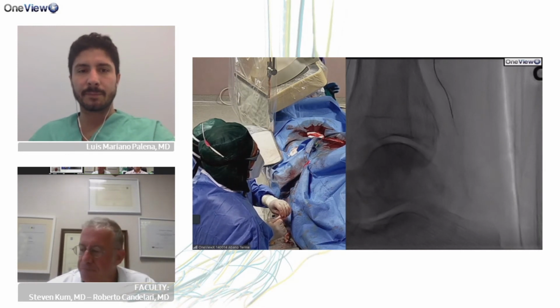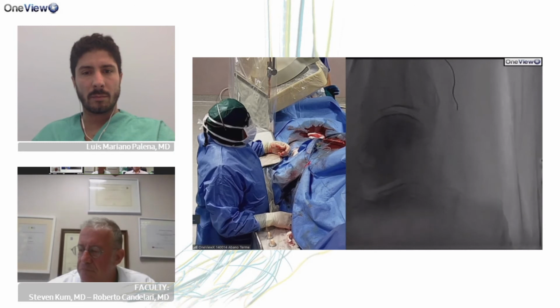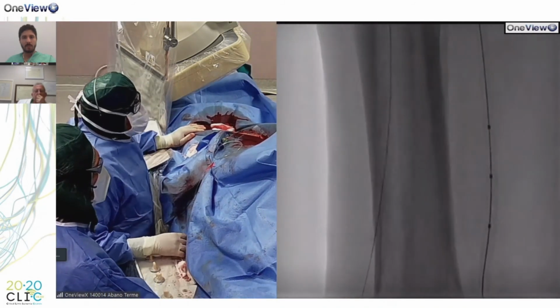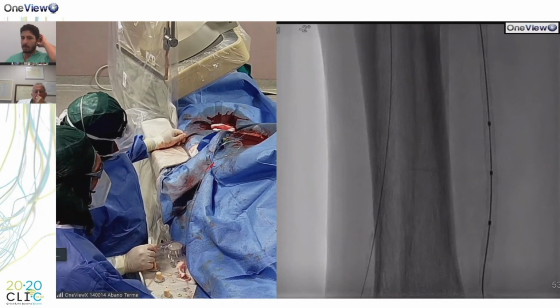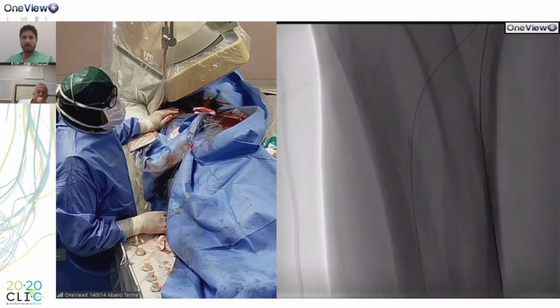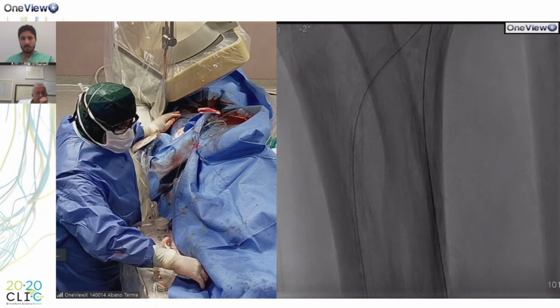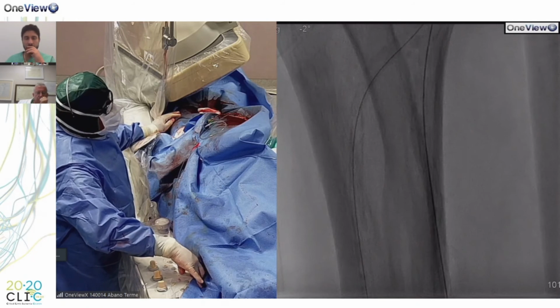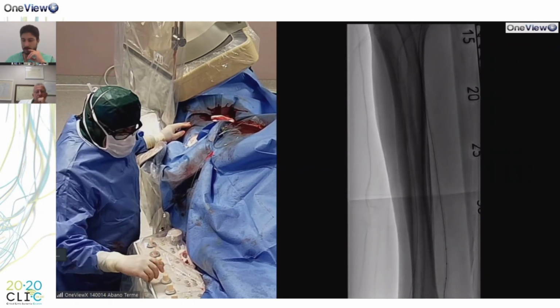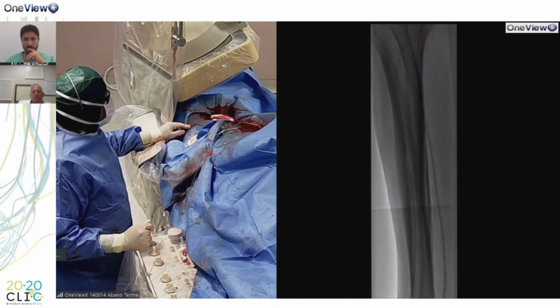Marco, can you hear us? Yes, of course. So guys, in the meanwhile, I have dilated the anterior tibial artery. With a 3 millimeter JADE high pressure 26 in the distal part, and after the IVUS measurement, we decided to dilate the proximal mid part of the anterior tibial with a 3.5 balloon. So despite the initial aspect, the real size of the vessel was bigger, and we could use a 3 millimeter up to the ankle and a 3.5 in the top.